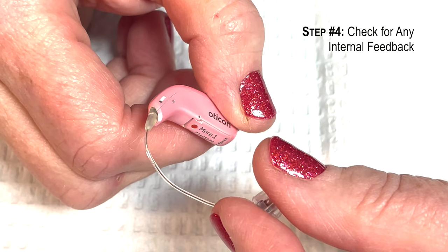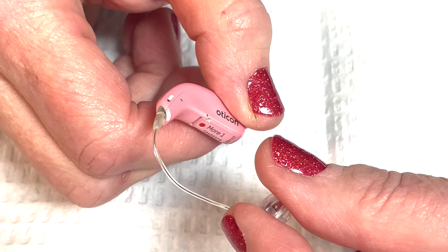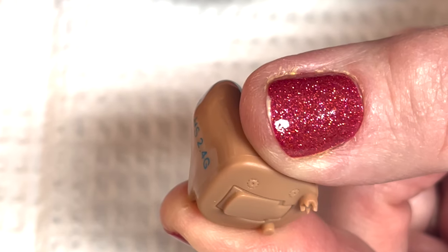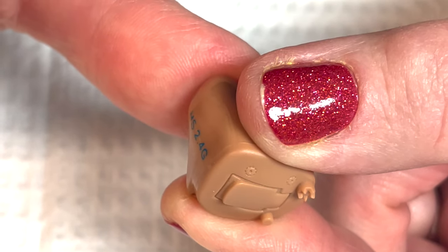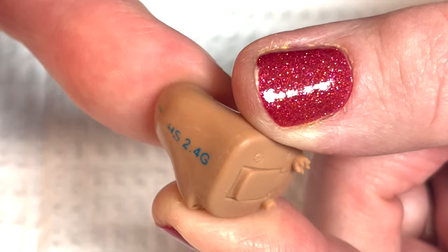Check for internal feedback by plugging the speaker with your finger. If the feedback stops, then the issue is improper hearing aid fitting. If the feedback continues, then there is a leakage somewhere between the connecting tubing and speaker resulting in acoustic leakage.